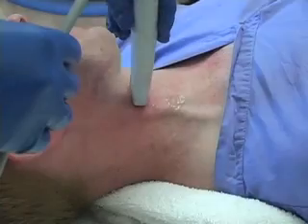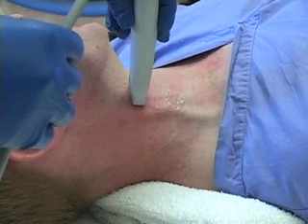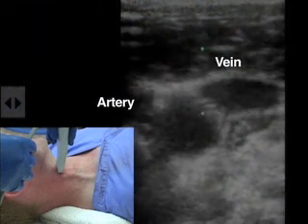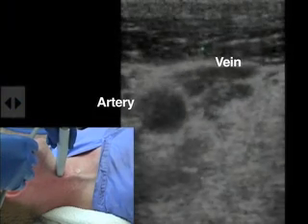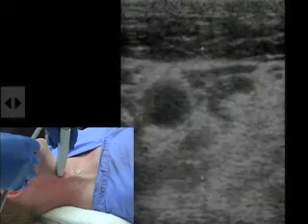of inadvertent arterial puncture. To identify landmarks with the use of ultrasonography, the probe is placed directly on the needle insertion site. The vein and artery are identified on the image as circular and black. The vein is identified by applying gentle pressure with the probe. The non-muscular vein will collapse easily, whereas the artery will remain relatively circular.